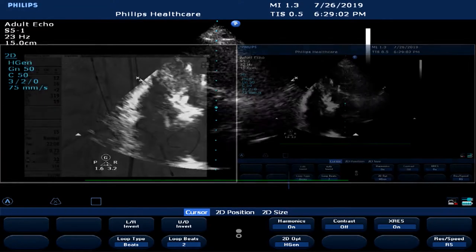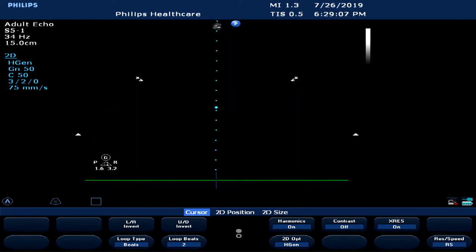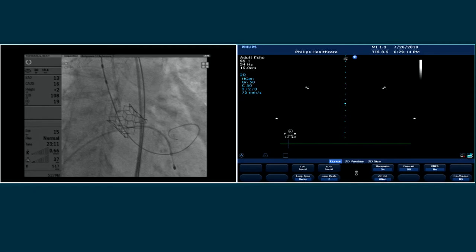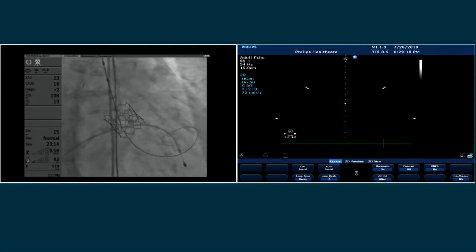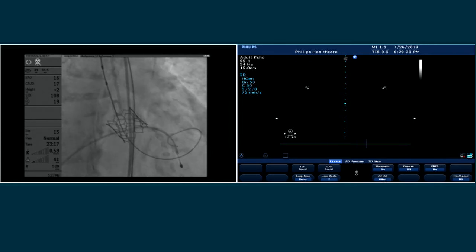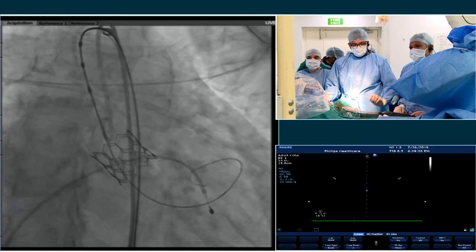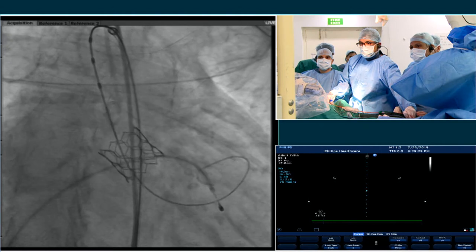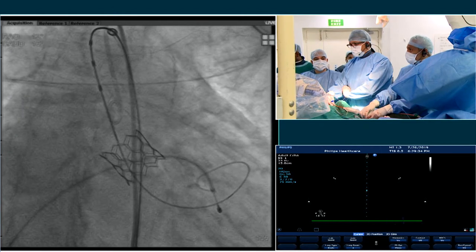Well, let's do an aortogram here. Okay, come off, please. Can we do 15 for 20, fluoro? Can we go a little bit RAO? RAO. No, sorry, no, go back. And go a little more caudal, right there, a little more. That's good, okay, that's good. Okay, ready? 20 for 15. Cine?